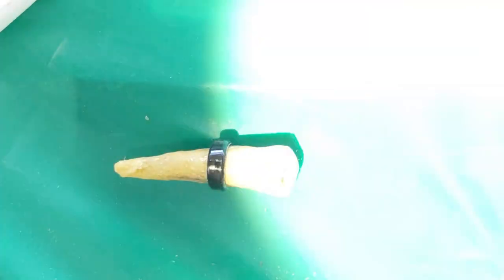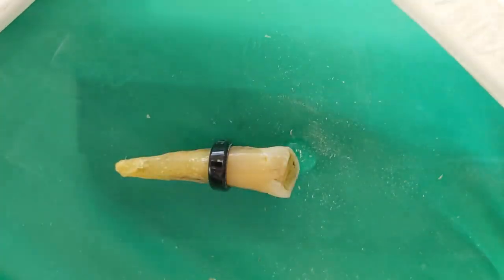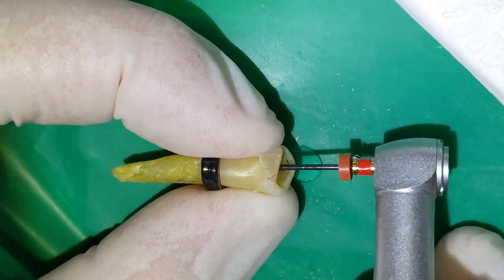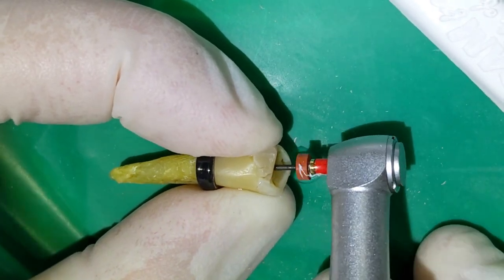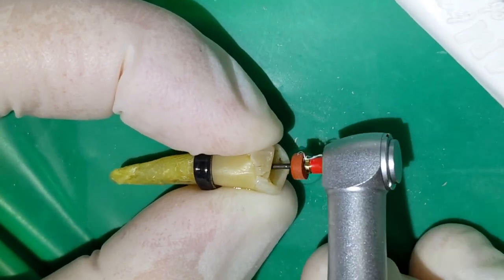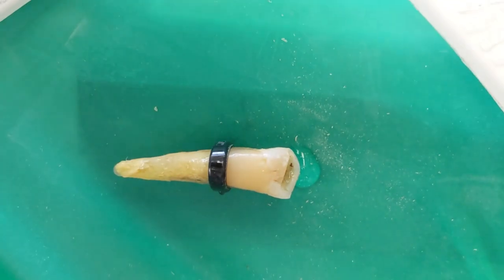And again, you don't want to use, let me put a little bit of water in there to act as a lubricant. You don't want to use excessive pressure because the file can break off and it's not going to be fun. Not the end of the world. The broken file usually just gets incorporated in the root canal filling at the end of the day. But if you can avoid it, you're better off. Okay, let's go back to the number 20 file.